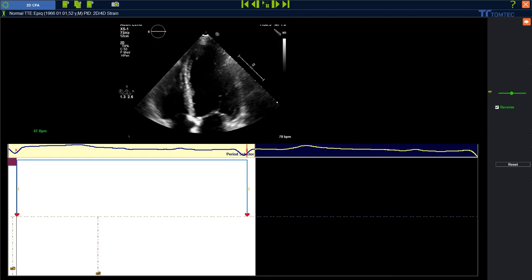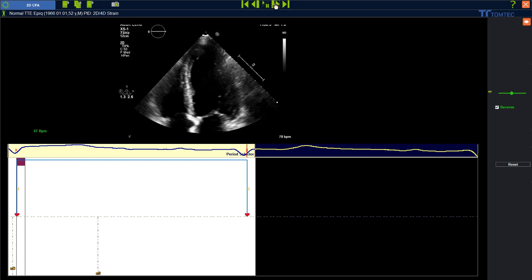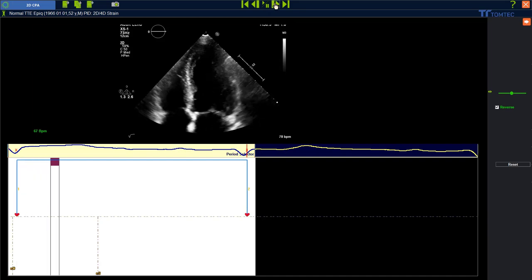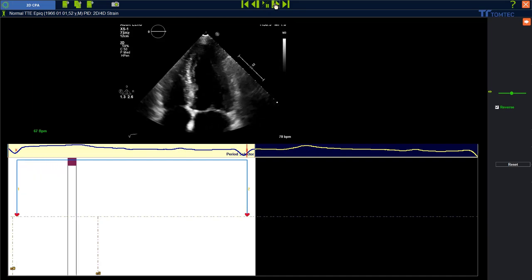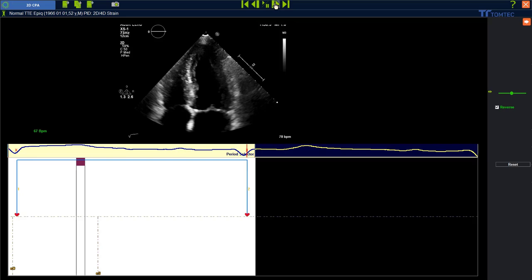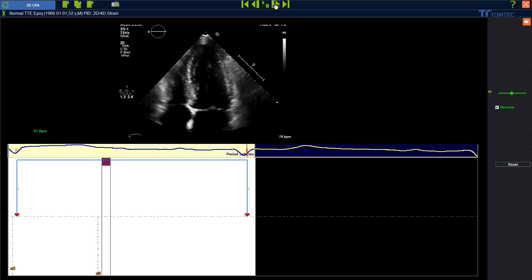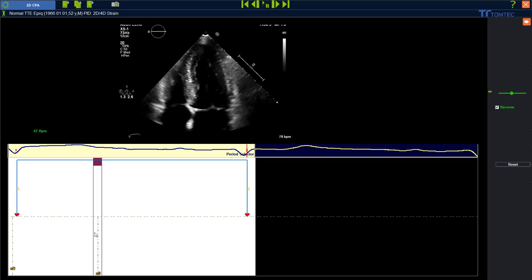We have now successfully set the R waves in the heart cycle. Please double check the end diastolic phase and then go frame by frame down to the end systolic phase. The recommendation of the task forces is to measure strain at the real end systolic phase, so go frame by frame and double check the timing information. If the timing information is not correct, feel free to adjust it.